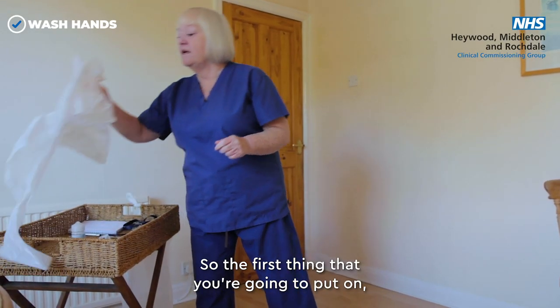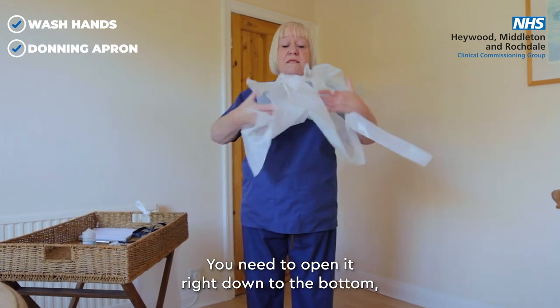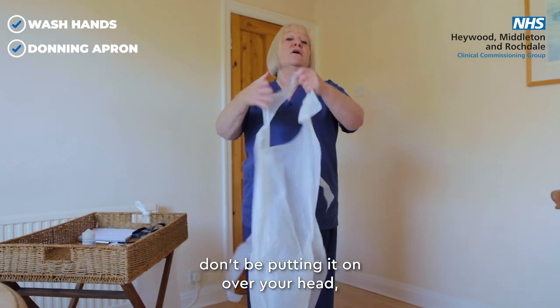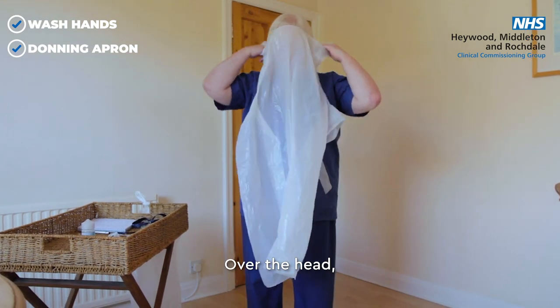The first thing you're going to put on is your apron. You need to open it right down to the bottom — don't put it on over your head with it stuck together around your body. Make sure it's nice and free, then go over the head.